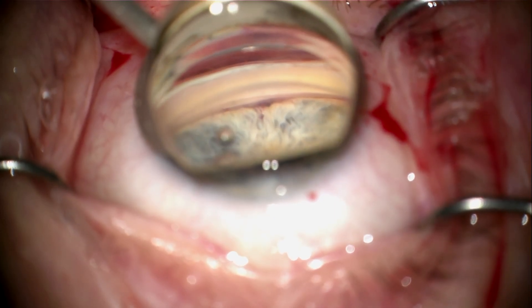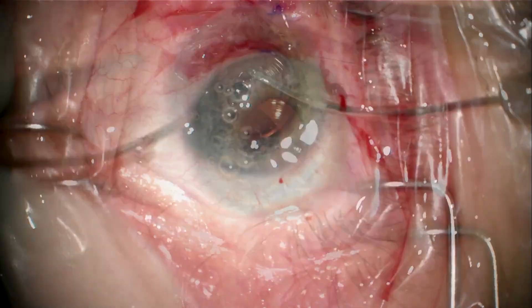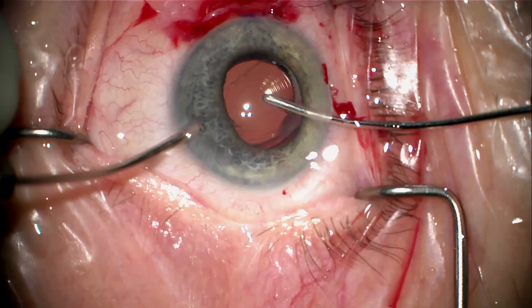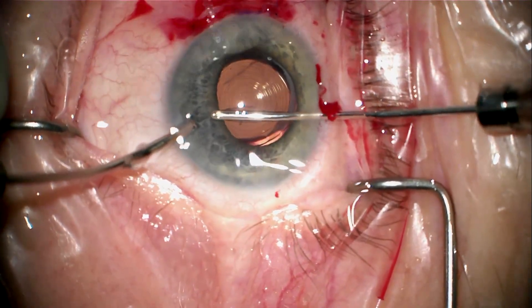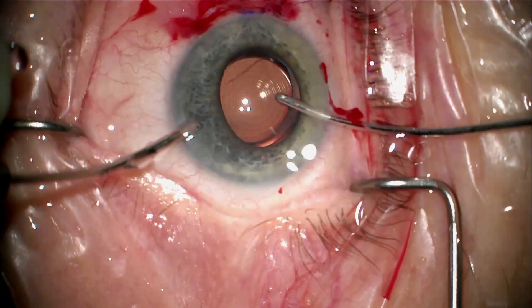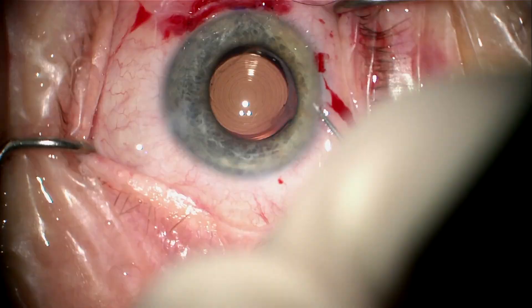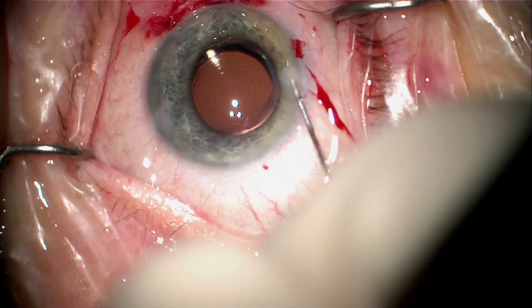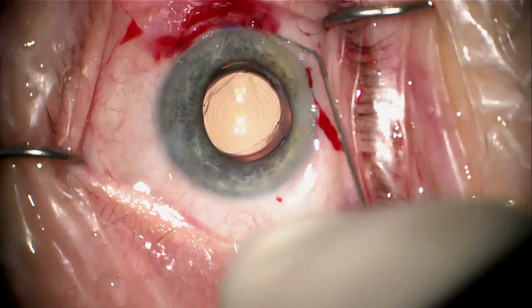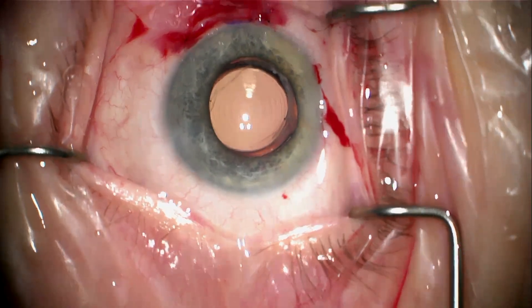This is nice to see. We then close conjunctiva, remove the viscoelastic from the anterior chamber with irrigation aspiration handpieces. I'm then going to confirm that I can firm up the eye with BSS when I stromal-hydrate the paracentesis. The eye feels firm and the case is completed. The patient's pressure was actually very high the next day — we had to control that with medication. Thank you for your attention to this case.